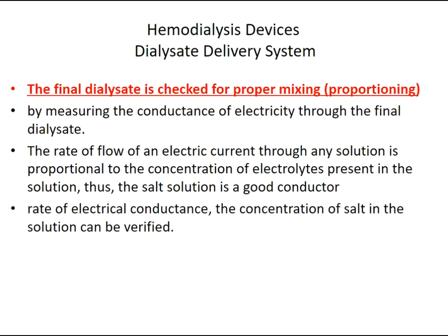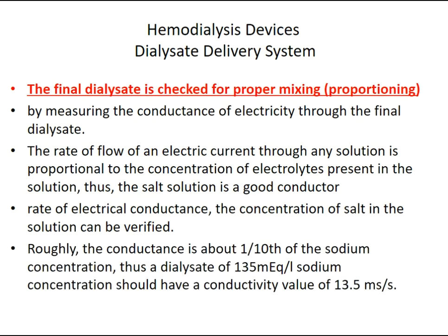By the rate of electrical conductance, the concentration of salt in the solution can be verified. Roughly, it can be estimated that the conductance is about 1/10 of the sodium concentration. Thus, a dialysate of around 135 milliequivalent per liter sodium concentration should have a conductivity value of 13.5.